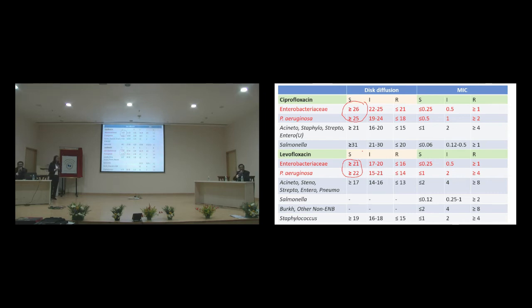This is very well known. Even in the CLSI document, it's very clearly written that it's not necessary for them to change overnight. They will validate, taking into account the reference method. Now they will test it. They will take 6 months to change over. Another 6 months, the new guideline will come. And then they have to be FDA approved also. So it takes almost a year. Later, a fresh card comes, an FDA approved card.